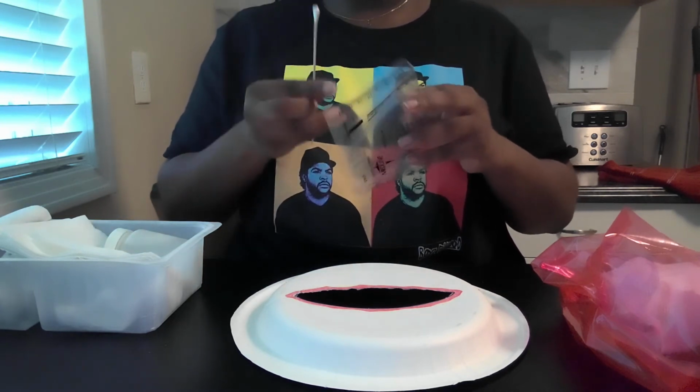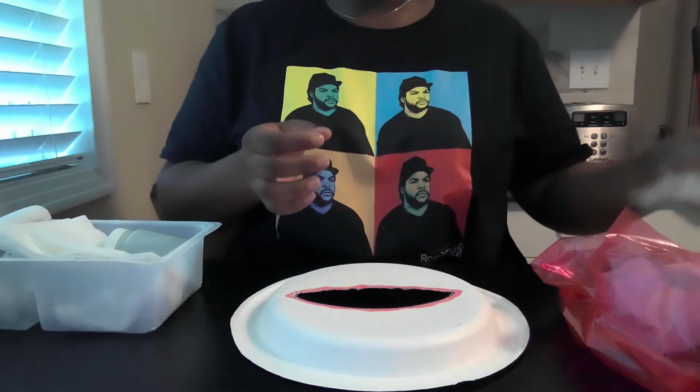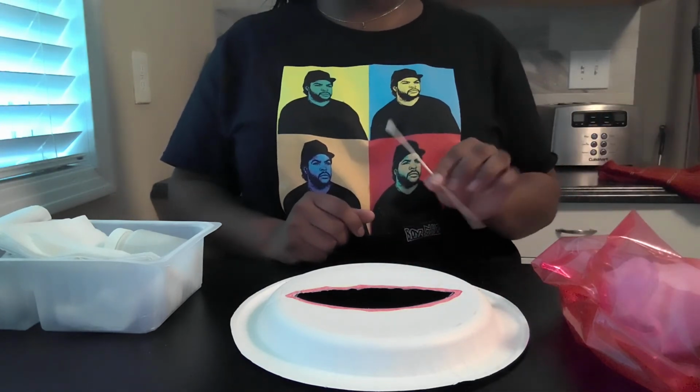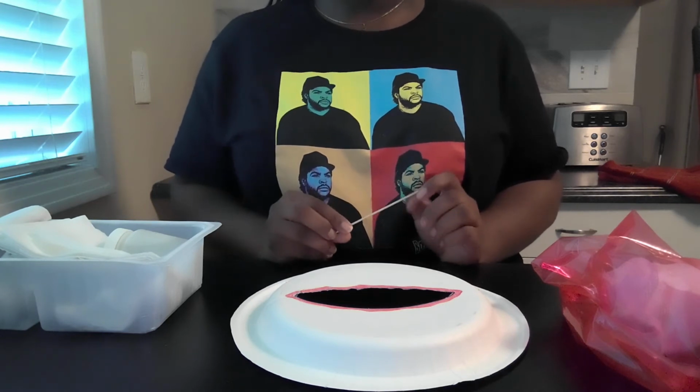So once you've done that, you just want to throw those away in the proper receptacle. Then you want to cleanse the wound. We're going to cleanse the wound with an antiseptic swab.